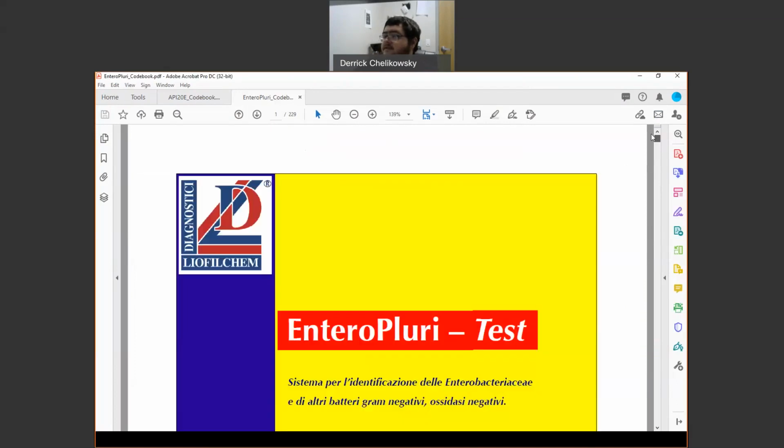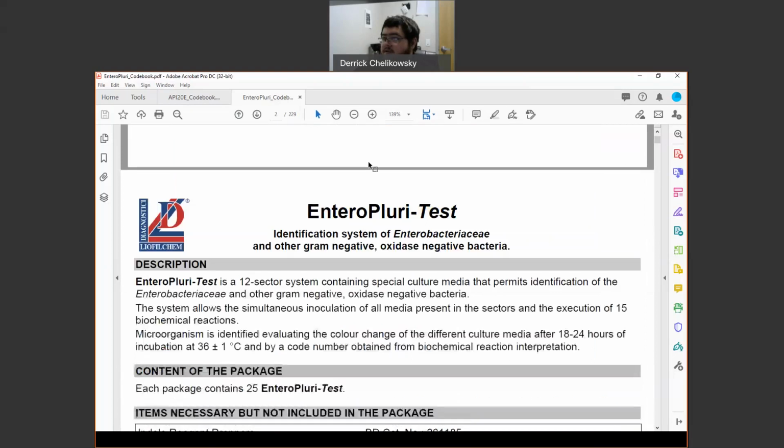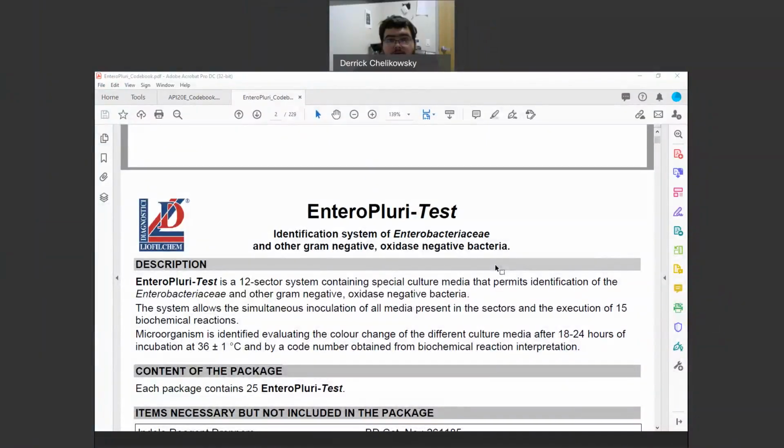So here is the PDF of the Enteropluri test. Make sure you're seeing this. There we go.